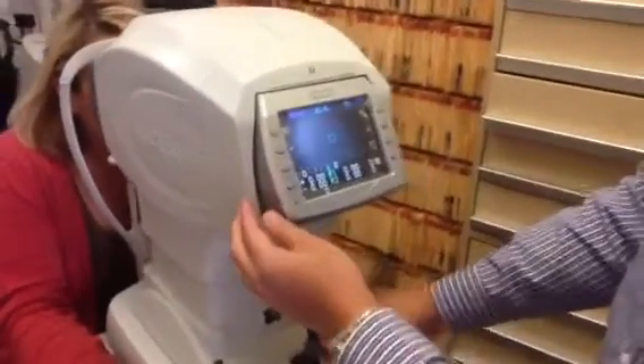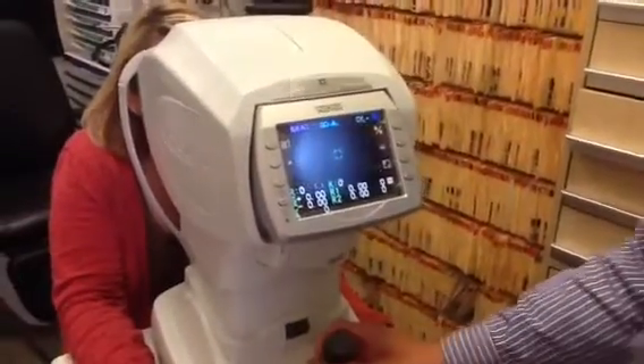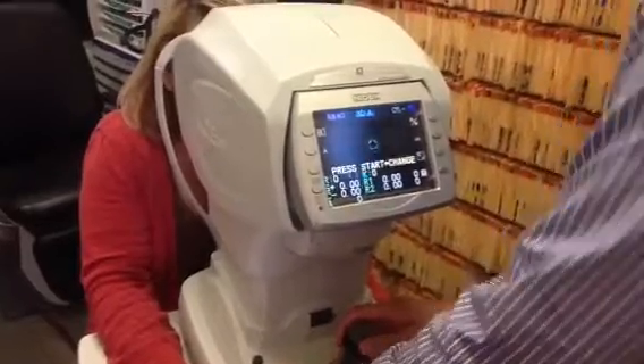This is the autorefractor and the tonometer. We're going to start the patient on this machine here. We'll align her and push her forehead forward.